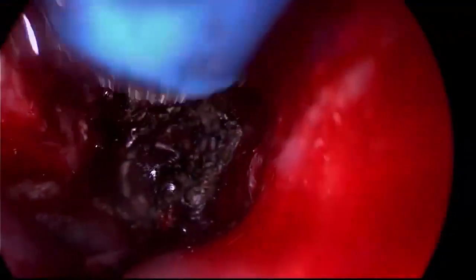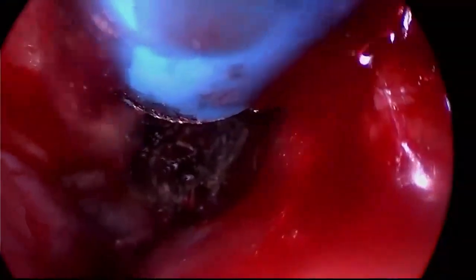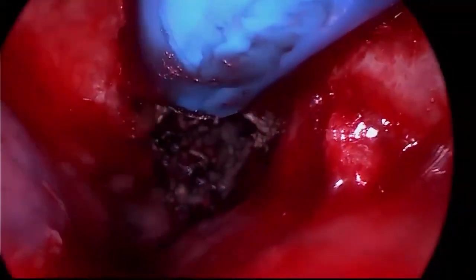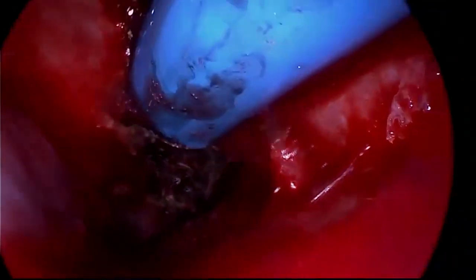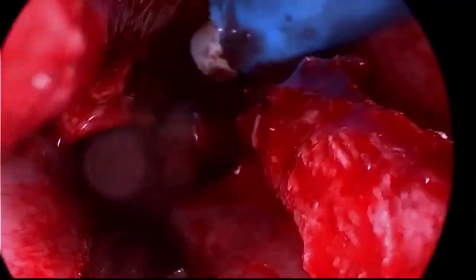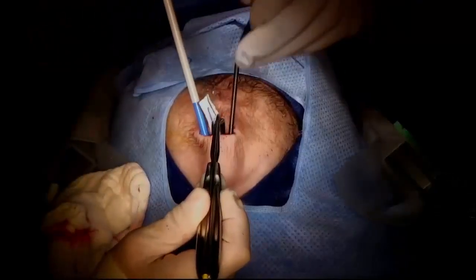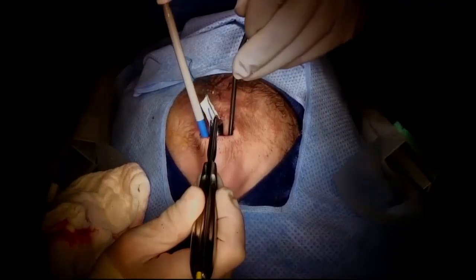The suction electrocautery is then set at 60 watts and slowly rolled from side to side, obtaining hemostasis of the diploic space as done in other surgeries. This maneuver is slowly done and advanced from distal to proximal to obtain complete hemostasis of the bone. An overhead camera now shows the same maneuver.